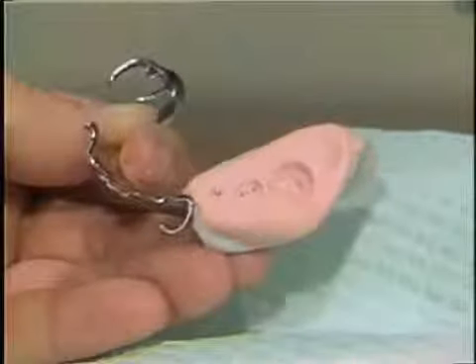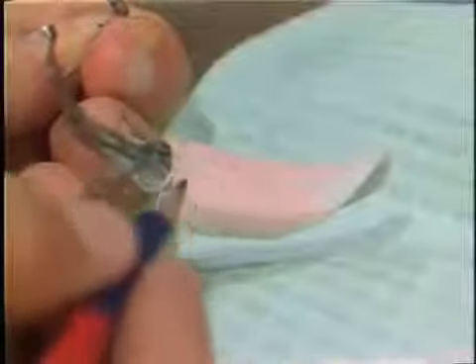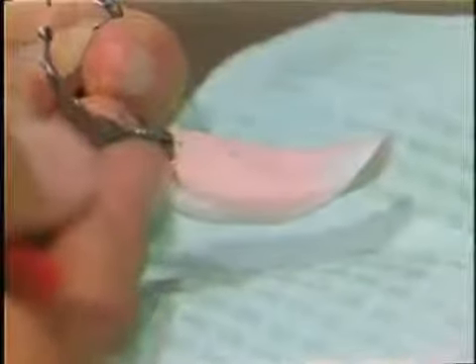Now I have an acrylic table already cut and relieved, and you notice that it is flat so that the wax can be added to the occlusal surface, and none of the indentations or the acrylic that were present when she just closed into the centric occlusion will interfere or do any of the guiding of the mandibular movements.